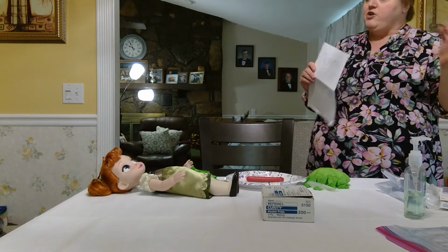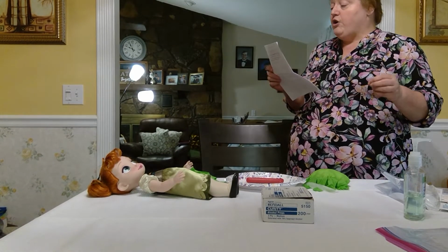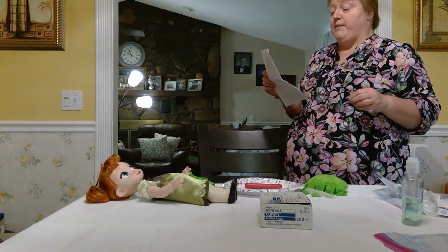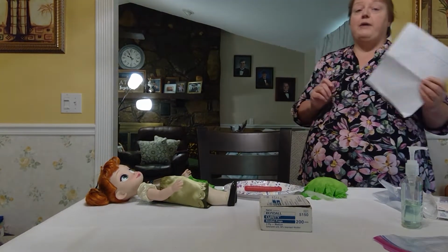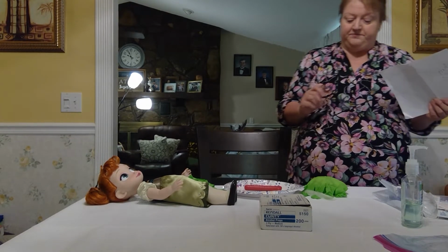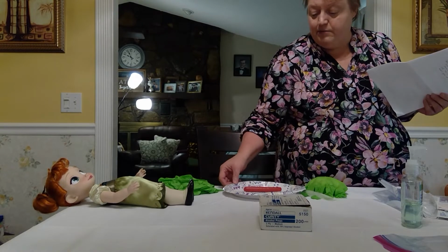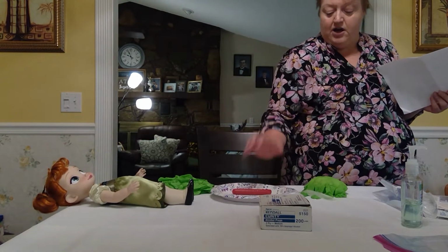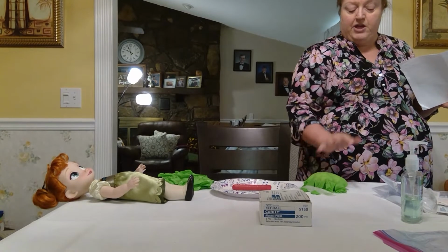All right, I've checked your allergies on your MAR when I first began, but can you tell me, are you allergic to anything? Is there any medications you cannot receive? She tells me no, so I'm able to proceed. We will not be injecting into a dummy. We're going to be injecting into our hot dog for our intradermal and into our glove for our IM and sub-Q.